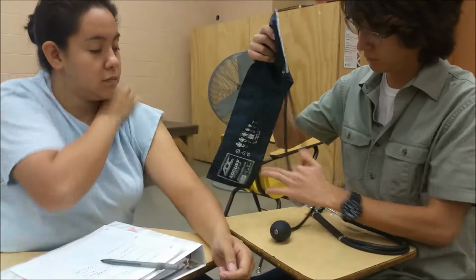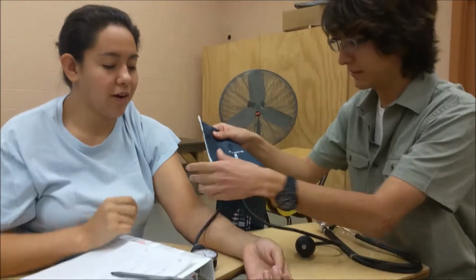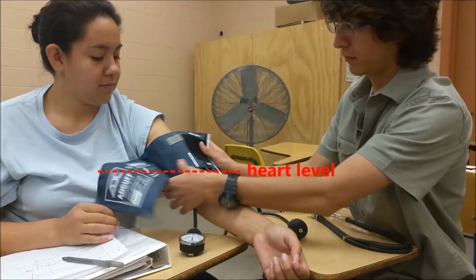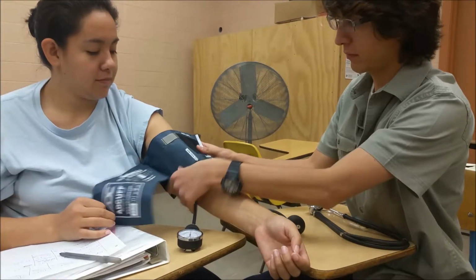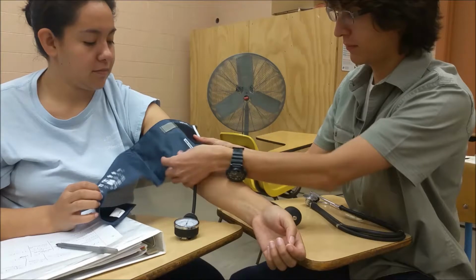Make sure the subject or patient has been seated for at least 5 minutes in a chair with back support. Feet should be flat on the floor and arms supported at heart level. It is important that the patient has not had any caffeine or smoked 30 minutes prior to the examination.